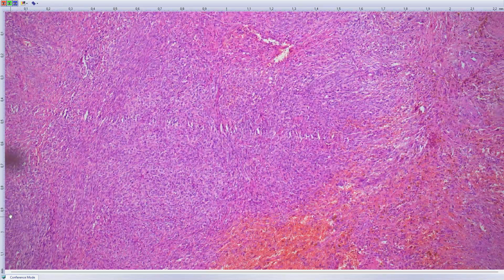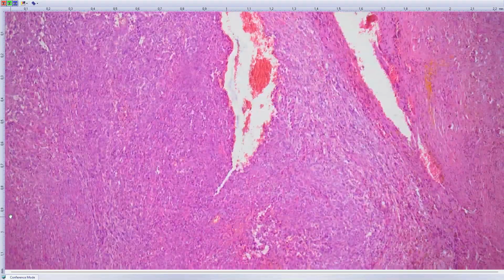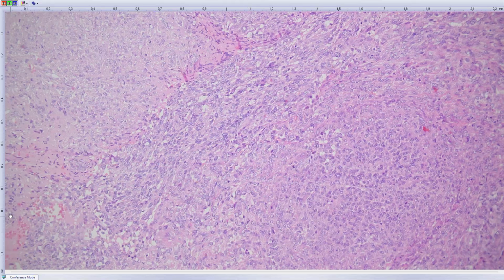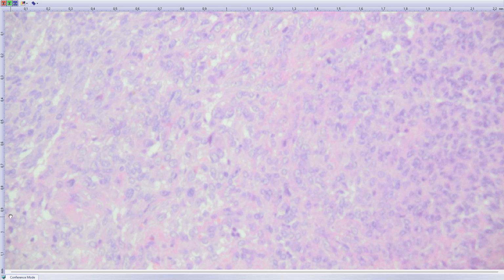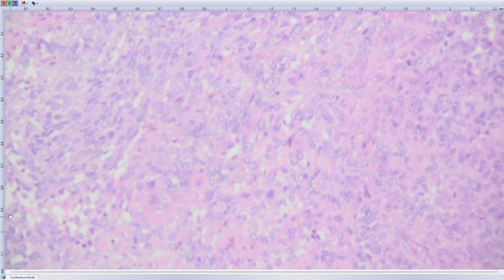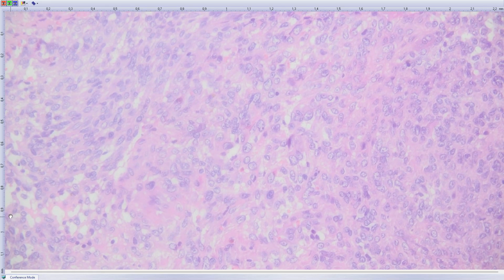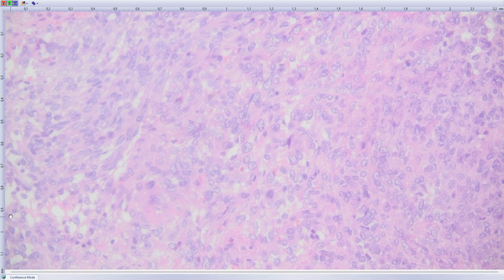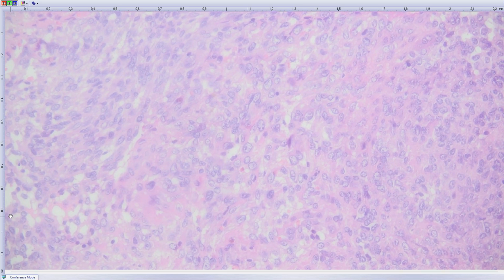And it's a low-grade sarcoma, which may metastasize in a few percent of cases, but rarely leads to death of the patient. Here again, the last thing to show, this H&E is a little bit better. These optically empty nuclei with histiocytoid features. Okay, that's all from us, and see you, hear you next week.